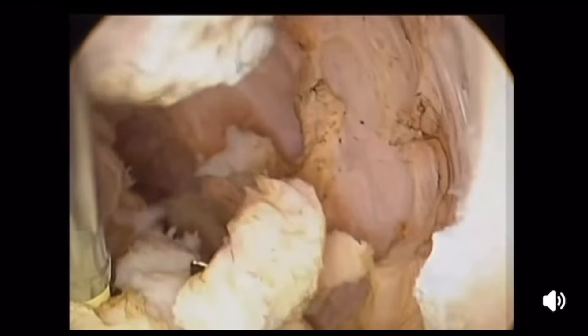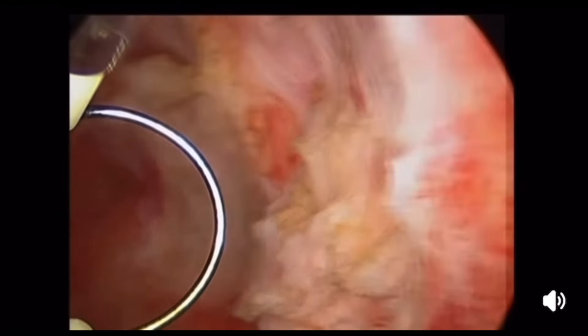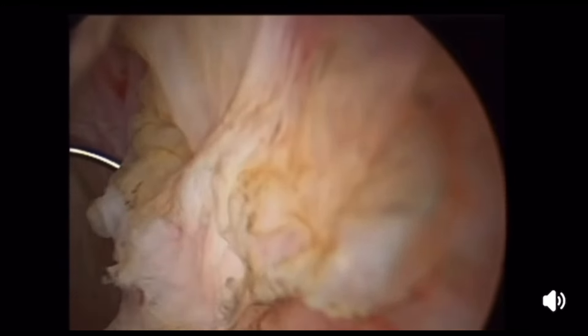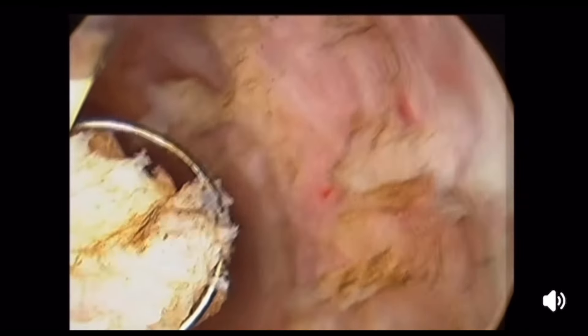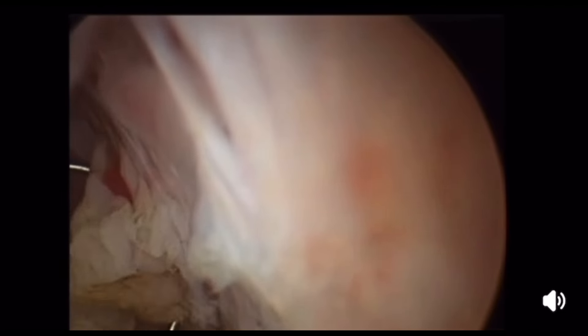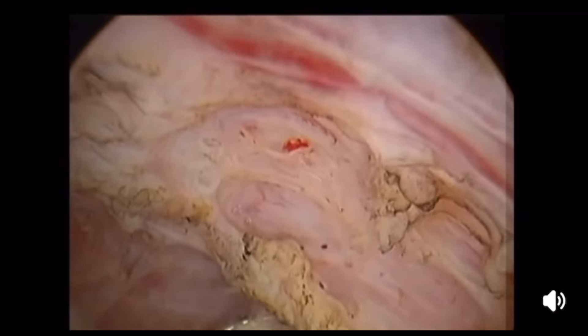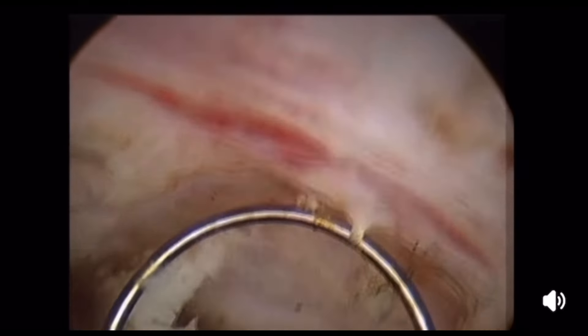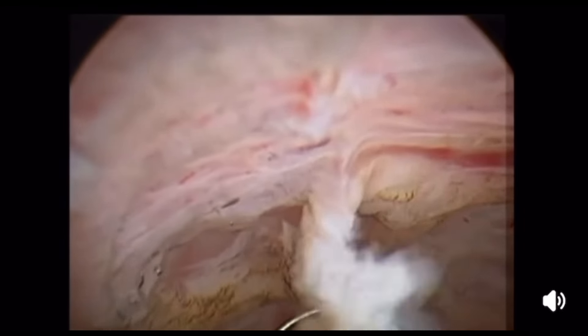Another very important observation: notice that since I started the resection I did not go out to clean until now — I cleaned the cavity only at the end to get the final view. Try to avoid going in and out several times because it has two major disadvantages. Number one, every time you go out the cavity collapses, and when you go in again you push some air — this creates a risk of air embolism. Number two, when you go in again after the cavity has collapsed with some bleeding, you cannot identify the view well. So keep cutting, push the debris to one side.